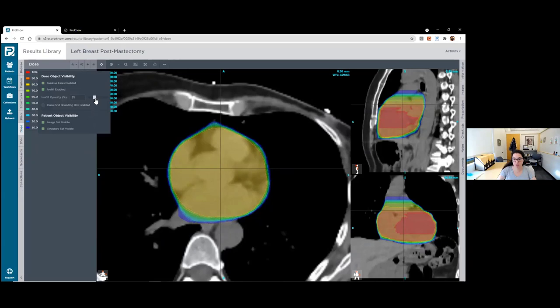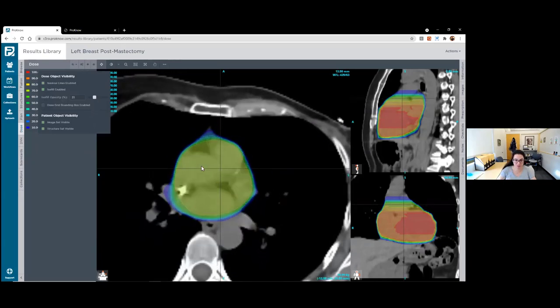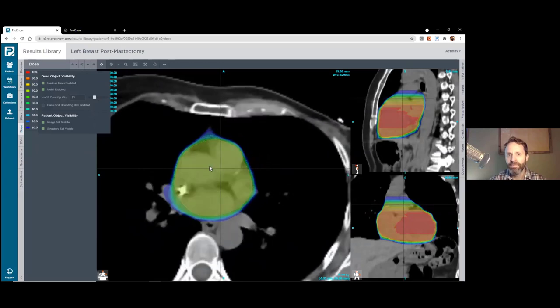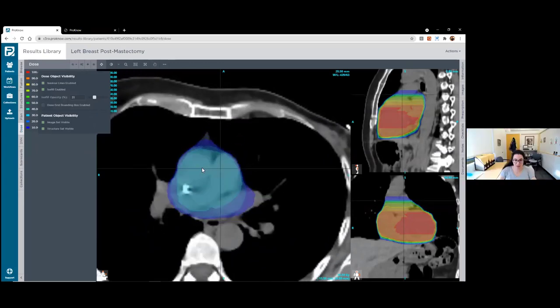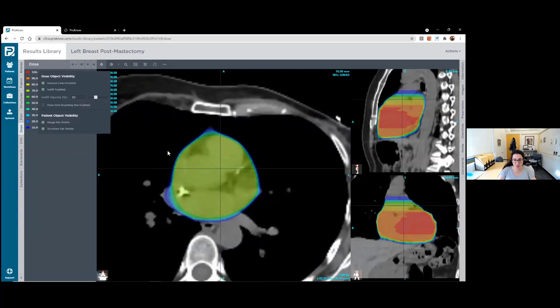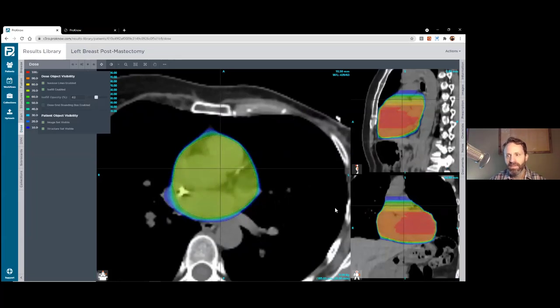Can we scroll up to look at the bifurcation? Sushil's point is a great one. There could be some disagreement about where the bifurcation ends and how inferior you'd want to go below it. If you scroll down a couple slices — so I would say that's well below the bifurcation, but it seems like there's a lot of disagreement there. The sagittal and coronal show that wherever we see this not-tight gradient, that's where people are starting to differ in opinion.